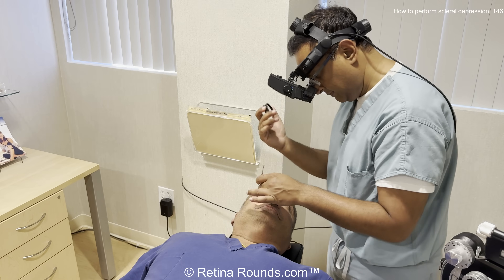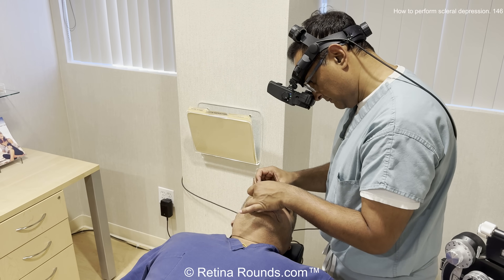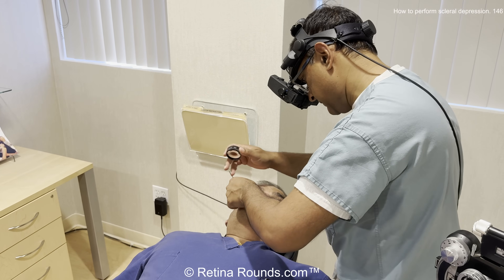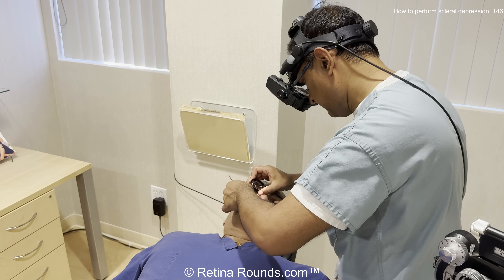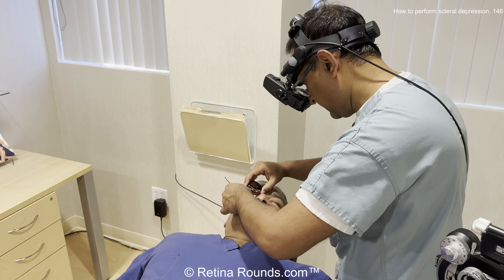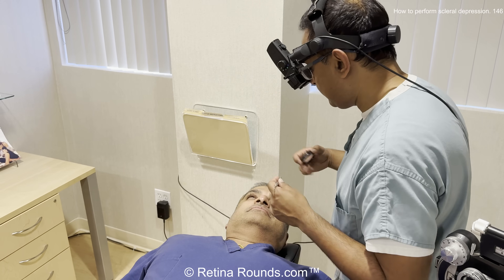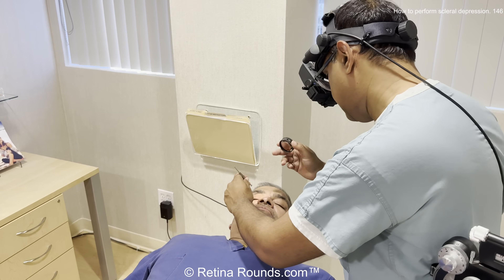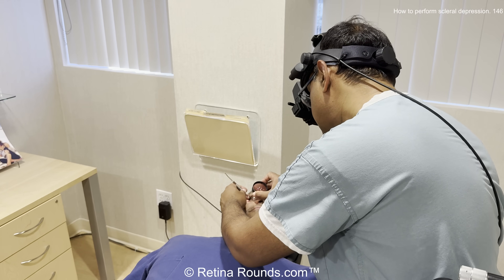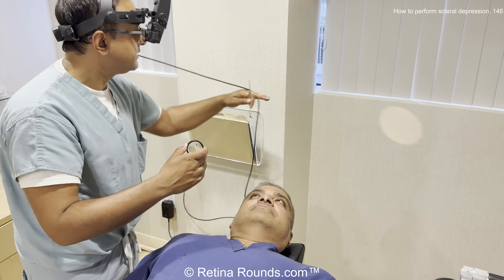Here I have the patient tilting his head and looking up and then down towards 6 o'clock. My depressor is at 6. If you draw a line between my two eyes, you can see that that line is going to be pointed also towards the 6 o'clock position. Now I'm examining the inferotemporal quadrant — again, if you draw a line between my two eyes, that line is pointed in the same direction as the patient's gaze and the location of my scleral depressor. If you stand perpendicular so that your eyes are pointed exactly 90 degrees away from where the patient's looking, you won't get quite as far of a view out to the periphery, and you may find yourself applying more pressure than is necessary.